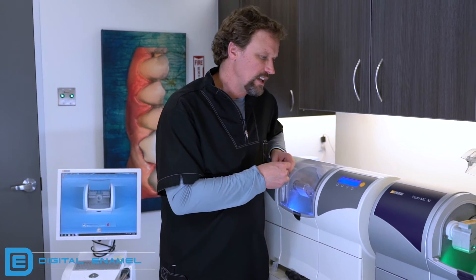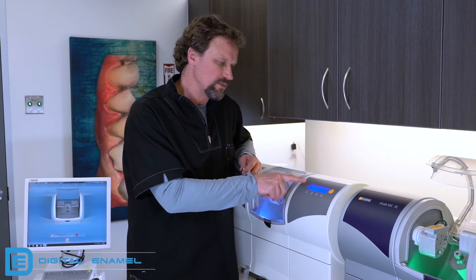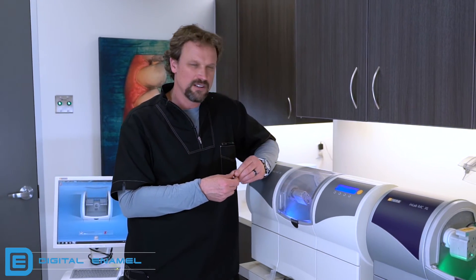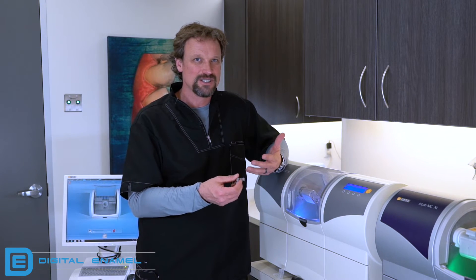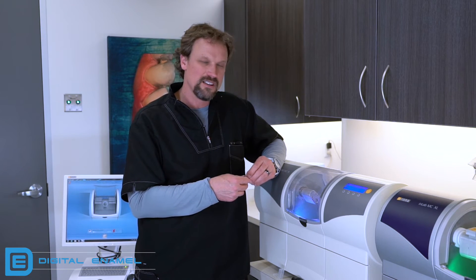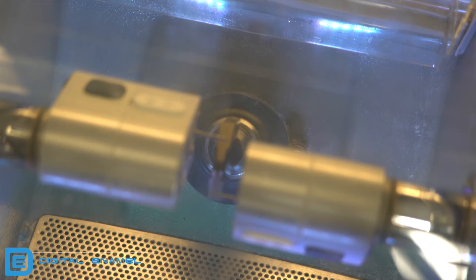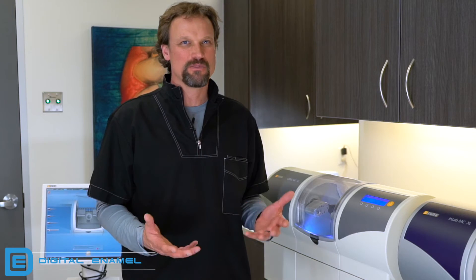This is going to take a number of minutes — it will tell you how long shortly. This is probably something you don't want to do right before a patient needs a restoration. Get this done in the morning or at the end of the day so you're not waiting on the calibration. The calibration process is now completed — it took about 20 minutes. So again, don't do this right before a patient; get it done at lunch or after work.